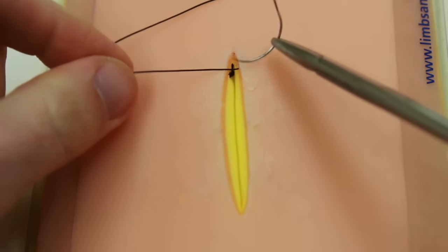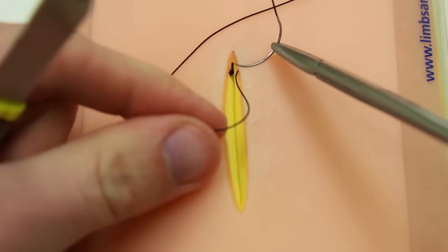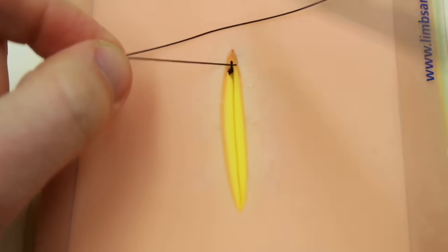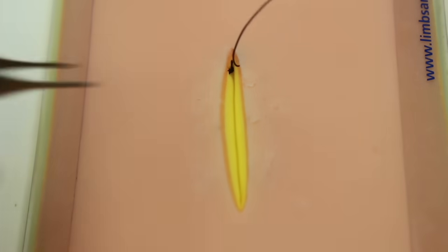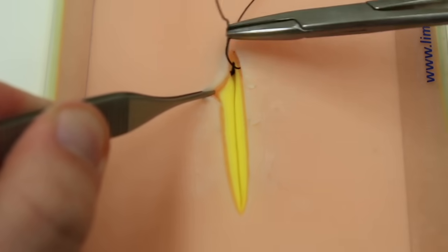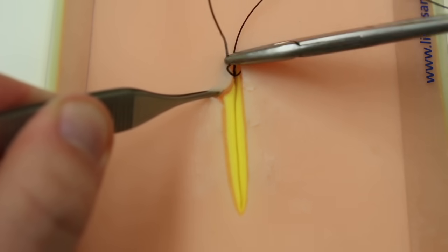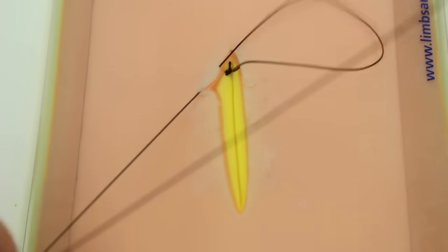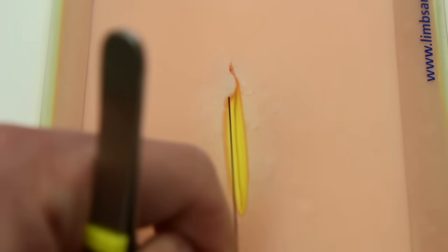Reloading your needle. Look where your suture comes out and stretch it across the incision. A little step back from that. In the dermal-epidermal junction. Going out right at that same level. Pulling through. Pulling tight.